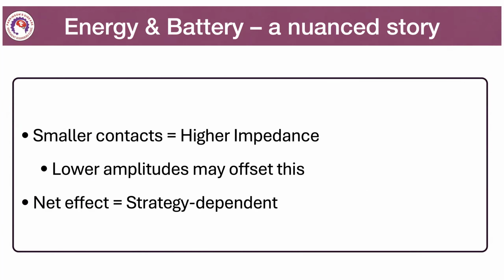There is always a concept. What we sell about the benefit is that probably you may need to use only a smaller contact, one contact, so the energy utilization is less and there could be a benefit. Theoretically, yes, everything is feasible, but you need to see the physics as a whole. Smaller contacts mean higher impedances, and higher impedances mean more utilization rates or more wear and tear.